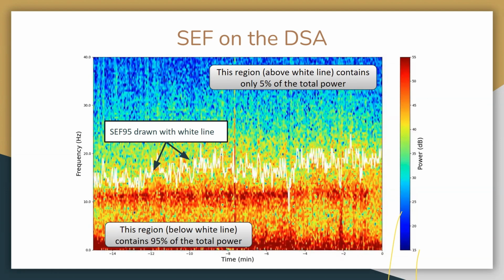Arturo: So just in the comparison, to bring it from the sound analogy, the sound analogy is the loudness. Is the intensity here effectively the number of neurons that are firing at the same frequency? It would be the total amount of electrical energy being conveyed at that frequency range. Some of that could be the number of neurons, but certain neurons are also going to activate more powerfully, so that's not a one-to-one analogy. But vaguely, it's how much energy is actually being conveyed across the patient's brain at that particular frequency band.